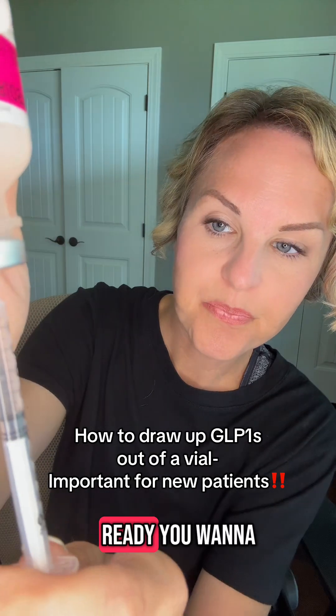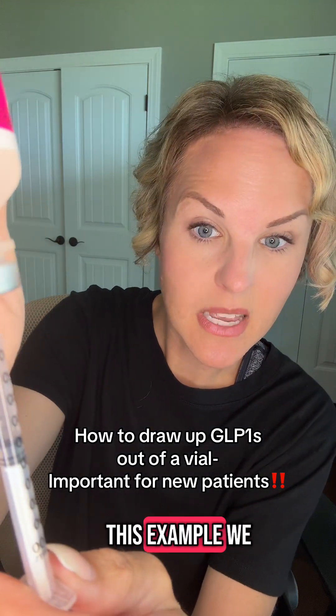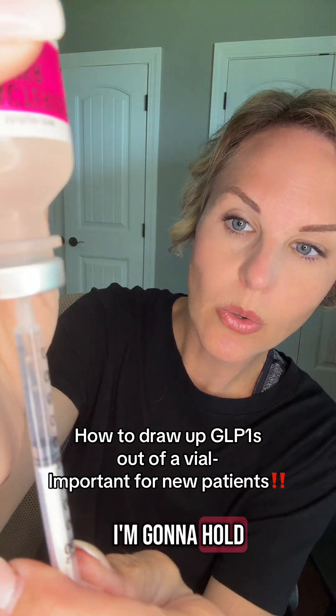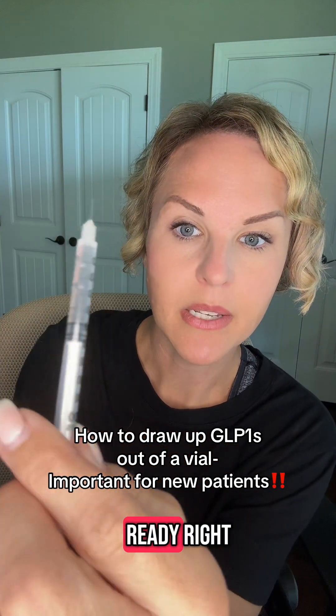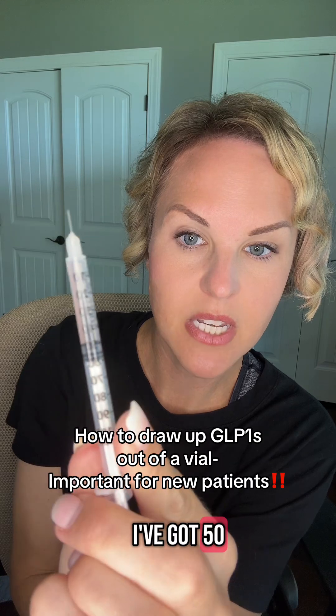When you're ready, hold it right there at your target dose — in this example, 50 units. Then pull it straight out and you're ready. So I've got 50 units here, and 50 is going to be right there on the 50 mark.